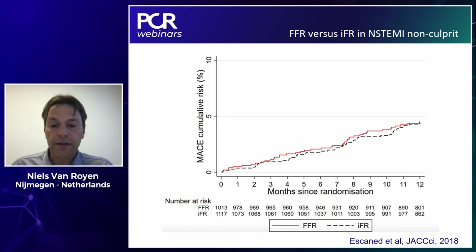And also there has been a study published by Javier, from the DEFINE-FLAIR and iFR SWEDEHEART trials, where they also did a sub-study in ACS patients, and there it was shown that FFR and iFR were equivalent also in the setting of non-STEMI.